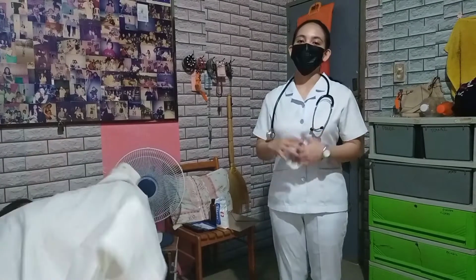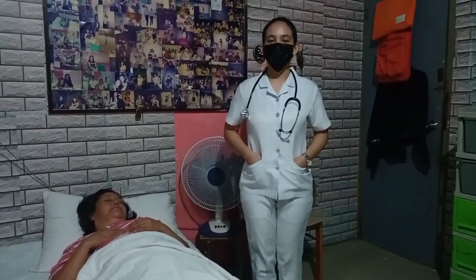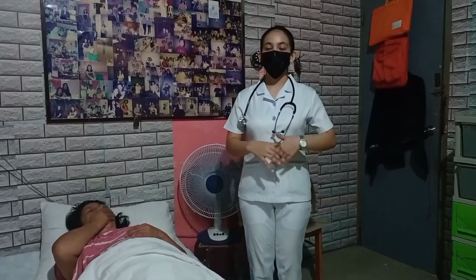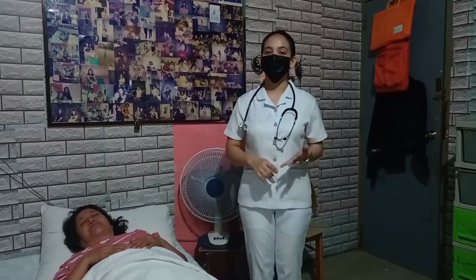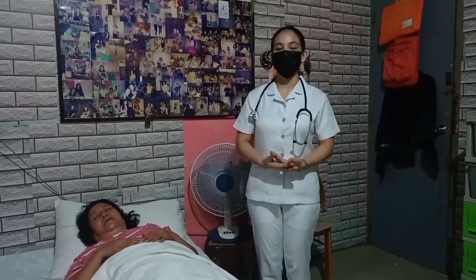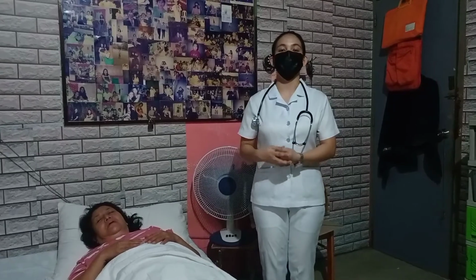After doing the assessment, please make sure that you don't reuse the syringe that you have used on your patient. The next step that I'm going to do is perform the subcutaneous injection. As the procedure requires, repeat steps 1 to 4, which is check the medical records of your client, introduce yourself and verify the client's identity, allow the client to ask questions.